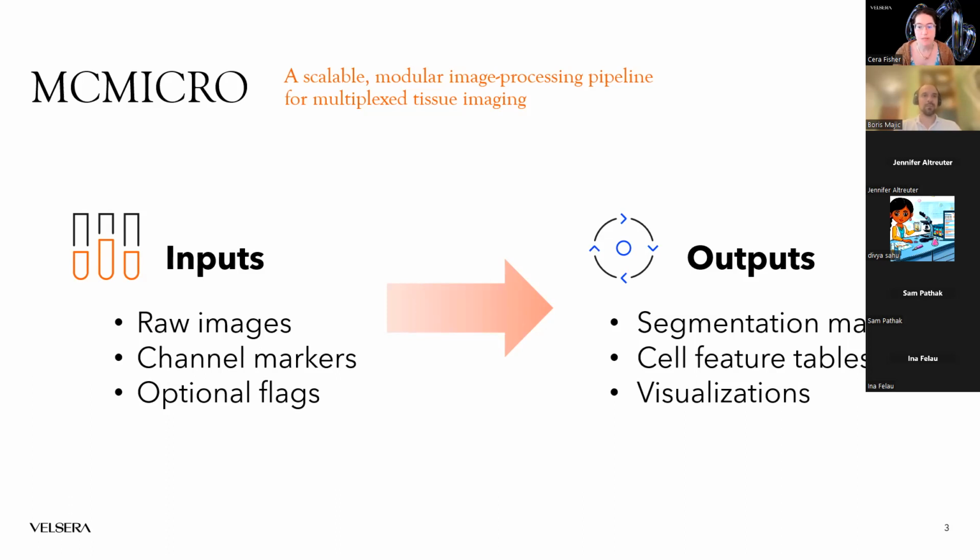Once the analysis is complete, several outputs are generated, including segmentation masks, counts tables, and really beautiful visualizations. The integration is beyond valuable for researchers and clinicians who process maybe dozens or hundreds of whole slide images and want to be able to draw really objective, non-biased conclusions from this data.